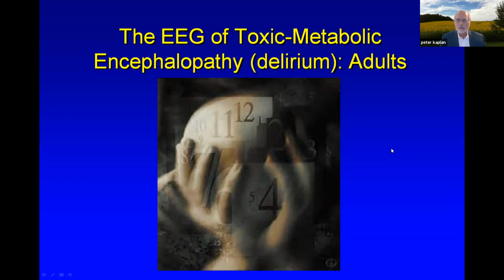We are often put off by EEG because the report may say, this pattern is etiologically non-specific. So you feel when you get that, well, everything looks alike and how does it help differentiate? But you should think of EEG as a triage tool to determine whether the patient in fact is awake but simulating, and it has a normal EEG, or diffuse slowing if it's encephalopathic, or sleep patterns if they are in fact too sleepy, or non-convulsive patterns if they have that.